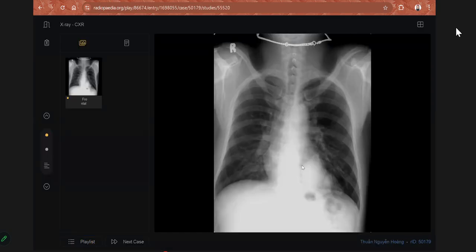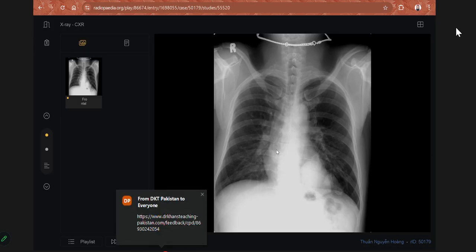You raise the possibility that this is either intrapulmonary or maybe mediastinal. Here you see the mediastinum, the heart silhouette is preserved, which means the pathology is actually in the posterior mediastinum. Regarding a mediastinal lesion on plain radiograph especially, whenever you see mediastinal pathology, first comment on which compartment: anterior, middle, or posterior. That is the first thing.